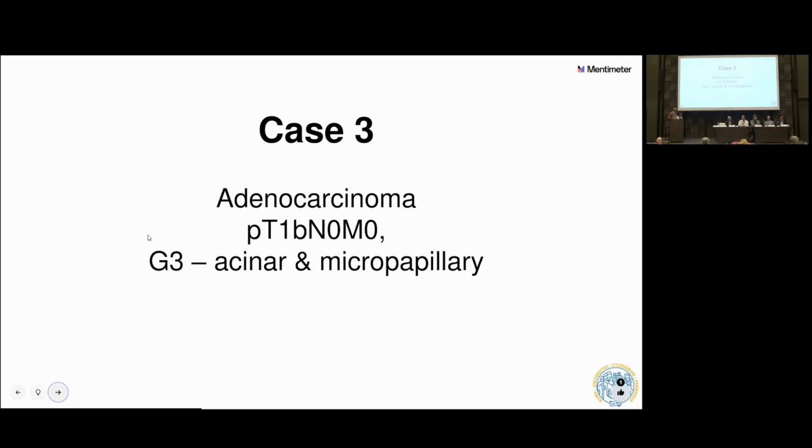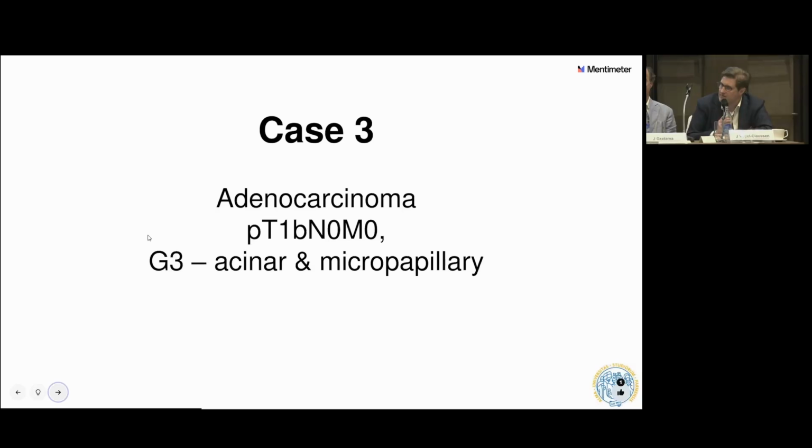Yeah. I think if you have a follow-up, as in this case, where you have a clear growth or increase in density, there is no role for PET CT because the growth trumps the mild uptake. If there's no uptake or mild uptake, it's concerning because there's growth. So I think PET CT has a role, but mainly at baseline, right? Yeah. Where you decide maybe you don't want to wait 3 months, only in a very, very few cases does it play a role, and the predictive value of the nodule is substantial for cancer.